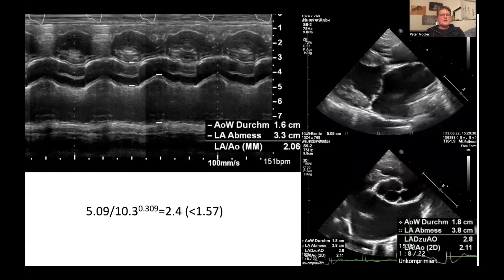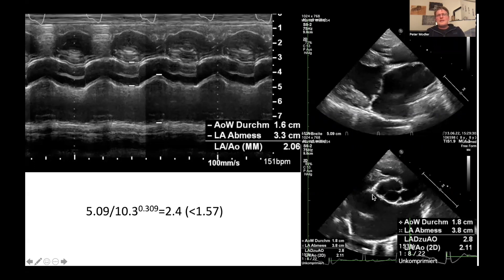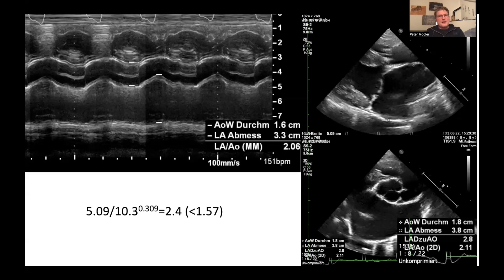In summary, M-mode LA:Ao is not recommended in dogs but can be used in cats. Shown here is the LAD measurement in a dog with left atrial enlargement due to mitral valve disease, demonstrating deviation of the inter-atrial septum towards the transducer. The short-axis LA:Ao ratio is 2.11, and my machine also calculates LAD divided by Ao in short-axis view — here it is 2.8, confirming considerable left atrial enlargement. Three-dimensional measurements of the left atrium work well but are not practical for everyday use.